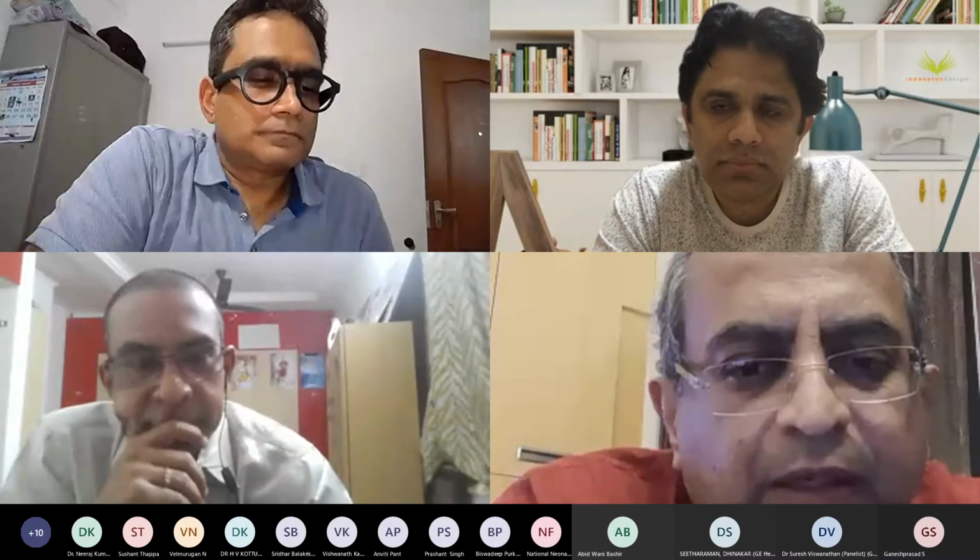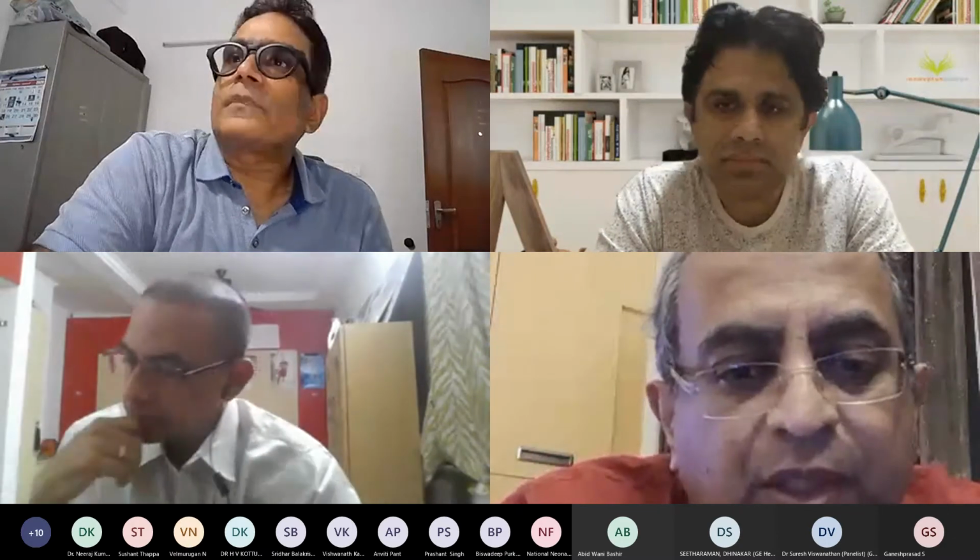Okay, Kishore sir. Yeah, I think Murugan touched upon a good point. Most of the monitors are fundamentally the same, but the significant point here is it's always better to take a reference of which hospital is using and what is their running costs, because ultimately AMC and CMC will determine what you are paying, and the cost of the probes, especially with the monitors. You have to use the probes for saturation and temperature, and that's where the cost can vary when running costs over a period of time.